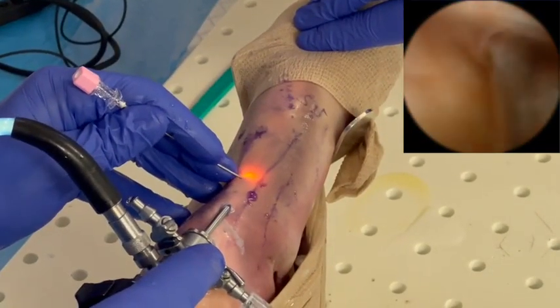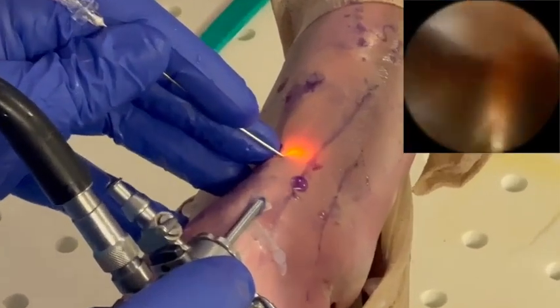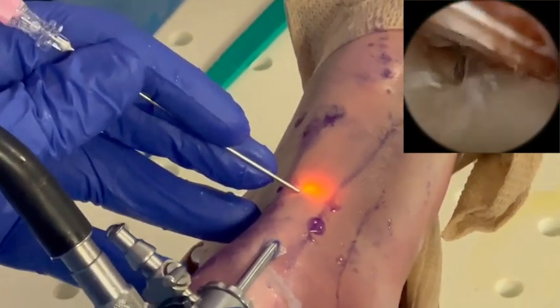Under direct visualization, microperforations are created within the substance of the tendon using a spinal needle in order to stimulate neovascularization.